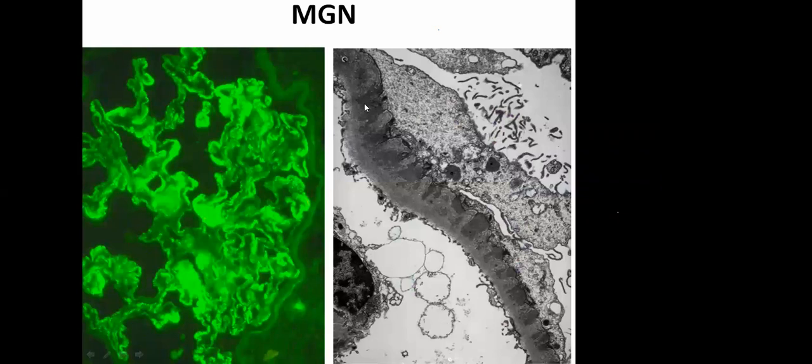And on electron microscopy, I've shown you the normal GBM. What you're going to see in membranous nephropathy, as in all these immune complex mediated diseases, is electron dense areas. These immune deposits appear as electron dense deposits. You can see these dark colored deposits along the GBM. This is the glomerular basement membrane. It has an endothelial side and an epithelial side. When I say epithelial side, that means visceral epithelial cell or podocyte.